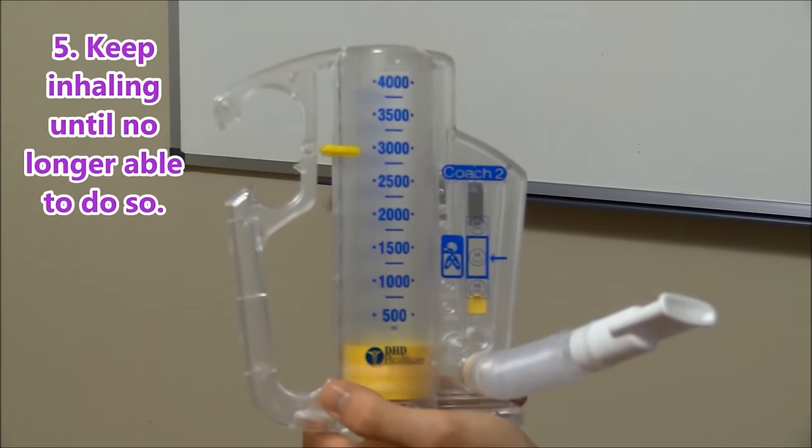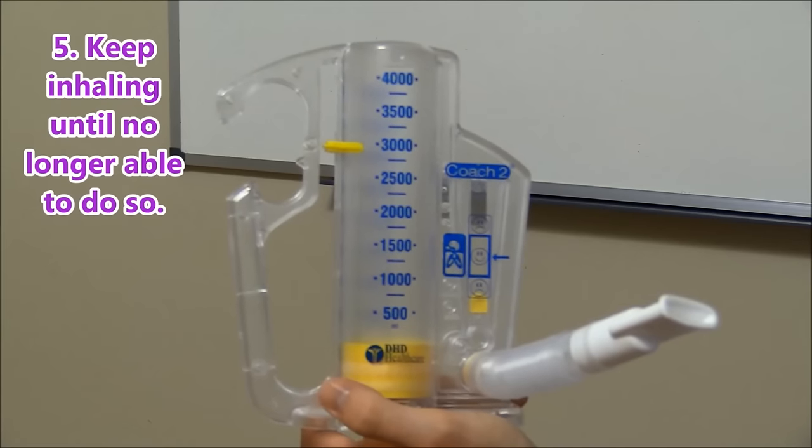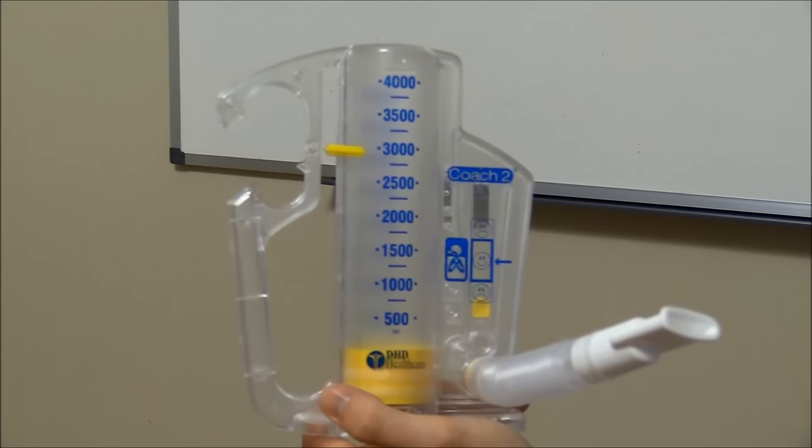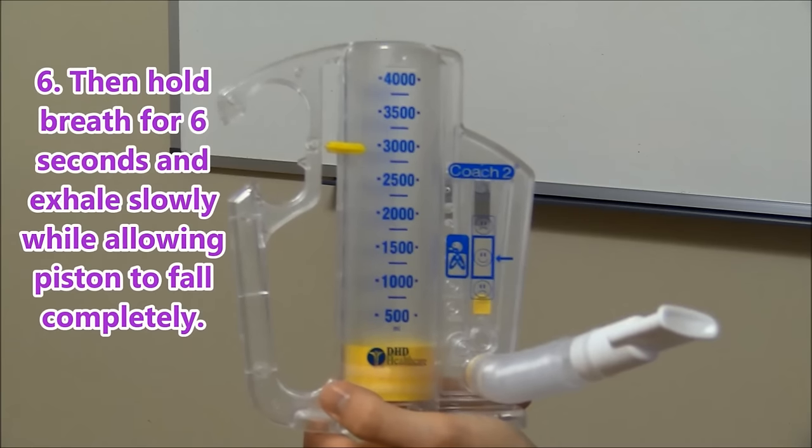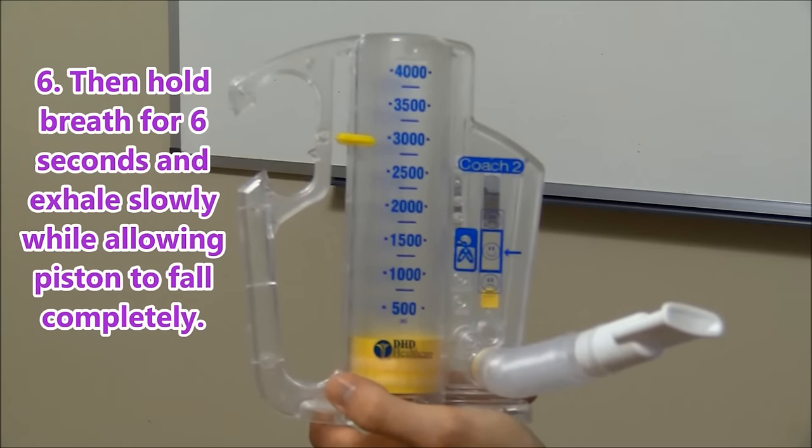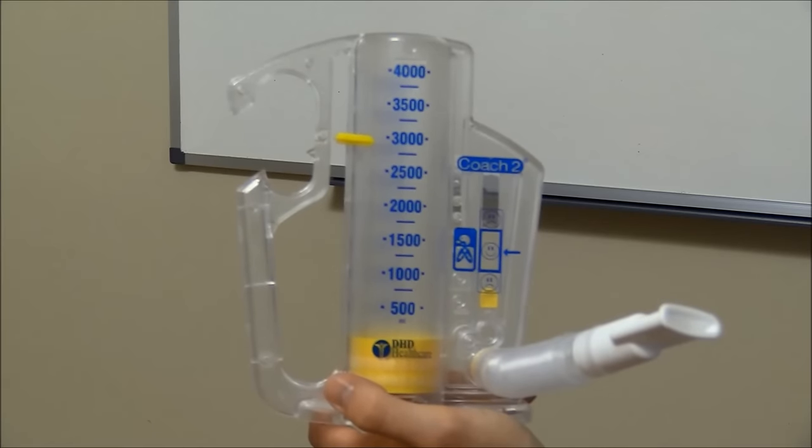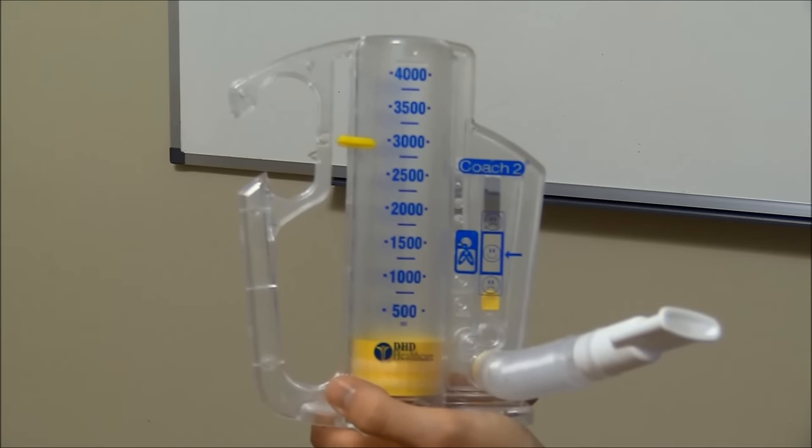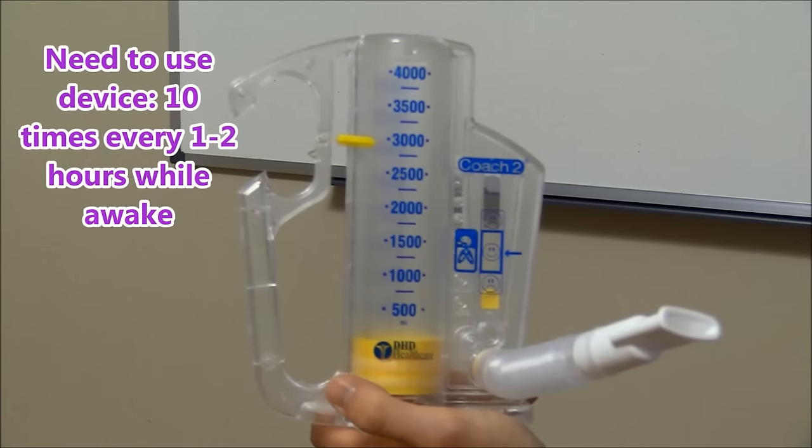Have the patient keep inhaling as deep as possible until they can't inhale anymore. And then they'll need to hold their breath for six seconds and then exhale slowly and allow the piston to fall before repeating again. And record the amount that they were able to get on the incentive spirometer.